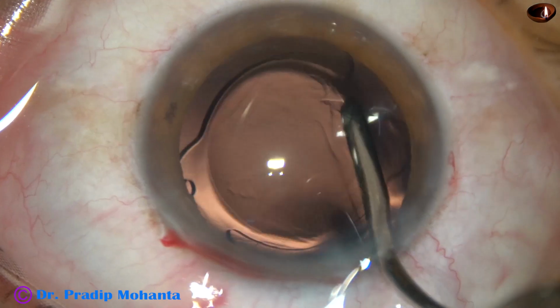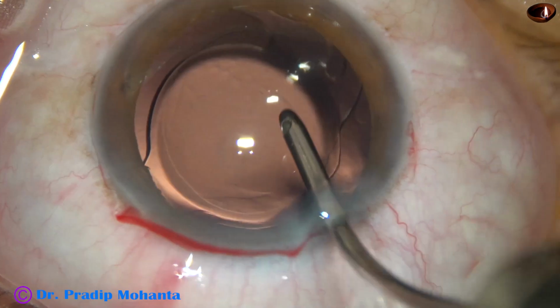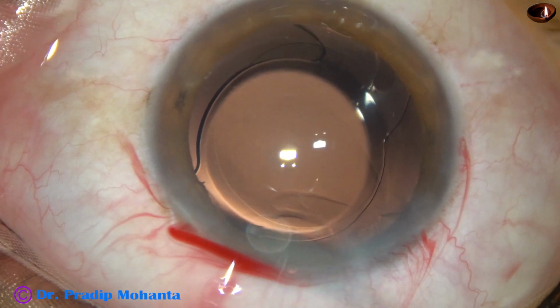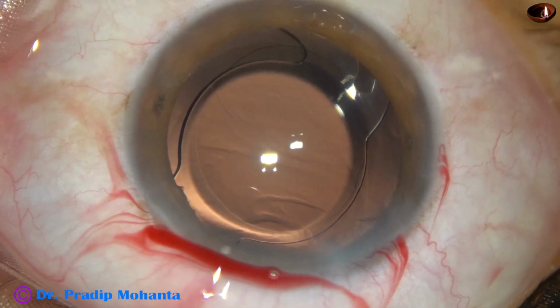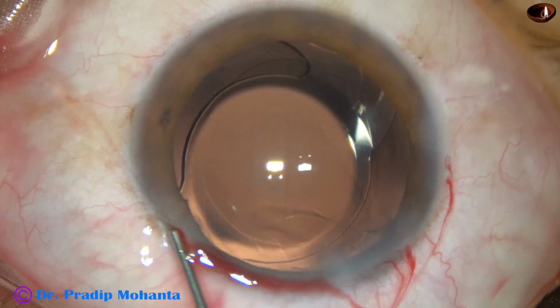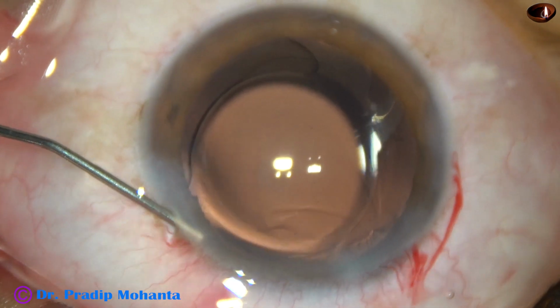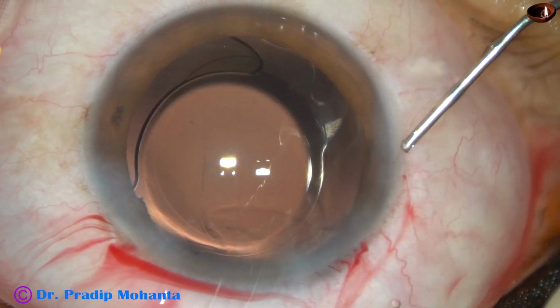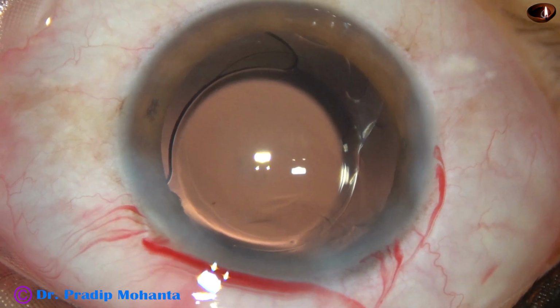The advantage is visco-induced intraocular pressure rise will not occur with this technique. And now this is moxifloxacin. The side ports are closed, and now we'll see there is a lot of visco sticking to the back of the cornea. We're going to remove that with a Simcoe cannula.